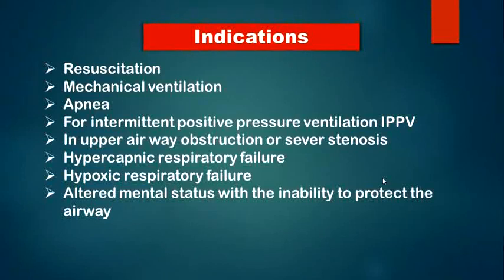Patient with altered mental status with inability to protect the airway. There is no mechanical problem in the ventilation system of this patient, but because of a low level of consciousness, he may not maintain the spontaneous movement of the air or O2 through the airway. So here the use of the Ambu bag is useful.